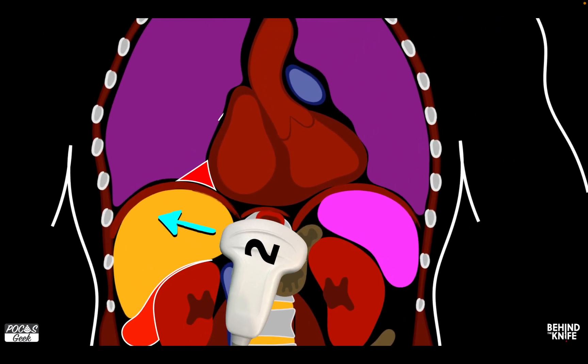After viewing the right upper quadrant, we want to move over to the sub-xiphoid region. We're going to rotate that probe and have our probe indicator towards the patient's right. We're going to use the left lobe of the liver and direct our probe up towards the left clavicle, and we're going to look for fluid to collect between the right side of the heart and the left lobe of the liver.